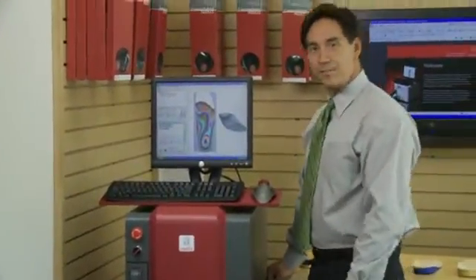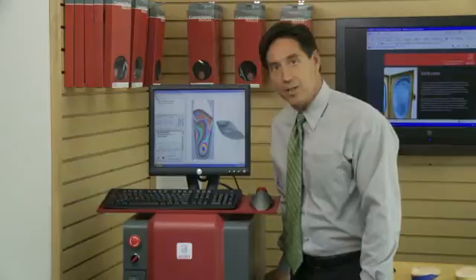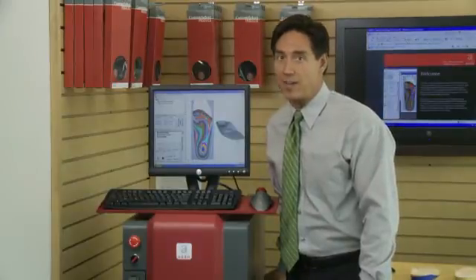Want to do everything in-house? Then buy a CAD-CAM milling machine from Amfit, and you can produce all of your custom orthotics in your own facility.